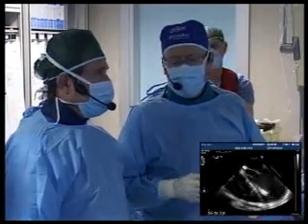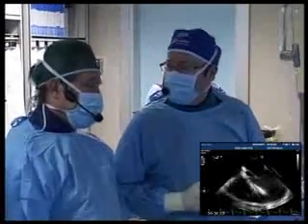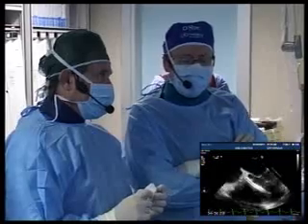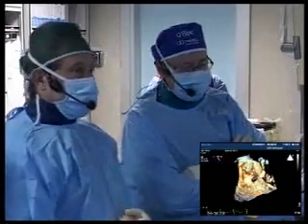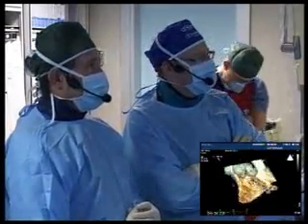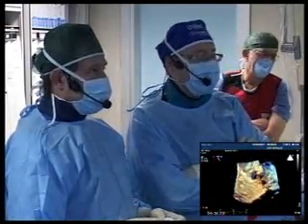I know she's had a comprehensive echo beforehand and they didn't see a duct, so we wouldn't do that. Yes. Maybe because of the high pulmonary artery pressure, you would not see a shunt? No, we measured the pulmonary pressures and they were normal. Okay, so it looks like it is an LV, and I think a brief shot of the LV angio didn't show any PDA, but anyway, it's a good point.